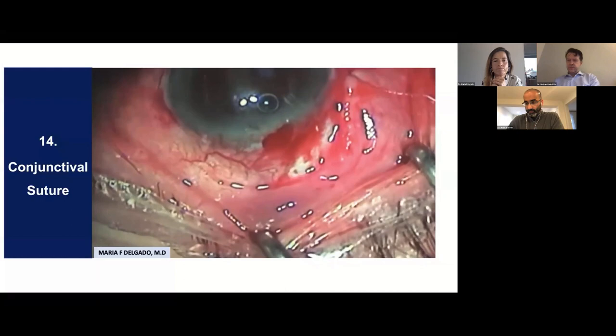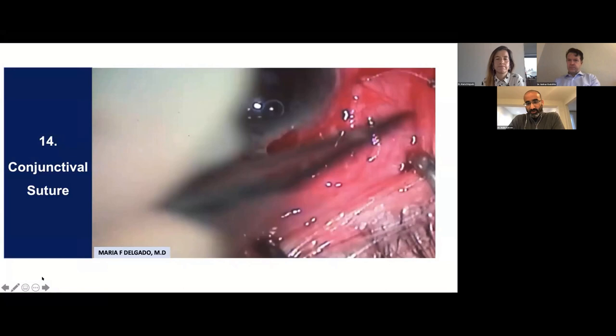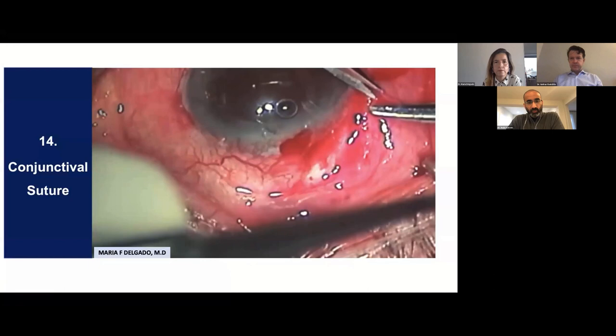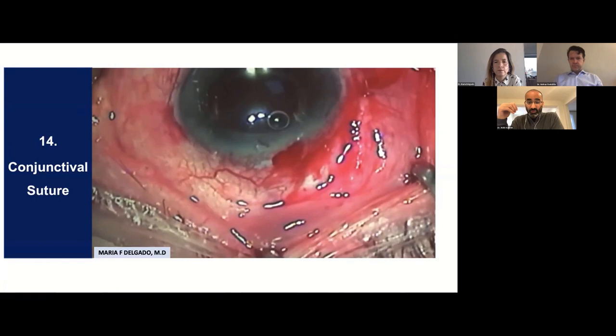Do you close with the Vicryl as well? So I close with Vicryl, either 7-0 or 8-0, 7-0 typically because we're using it for the bridle suture, as you said. We do only two interrupted sutures, and we use glue for most of the closure. In some cases, with very mobile conjunctiva, we'll just do the Tisseel glue. We won't use any sutures.